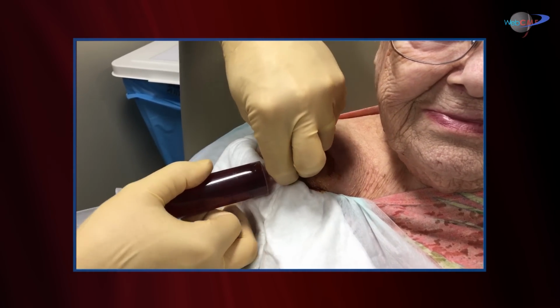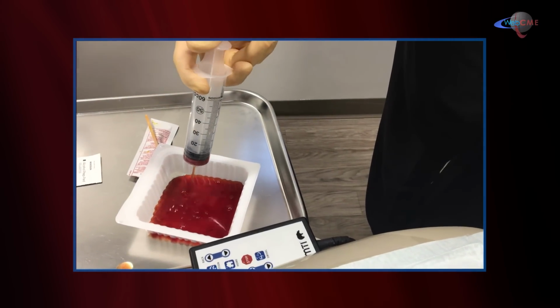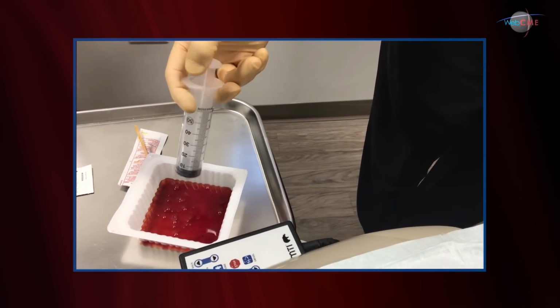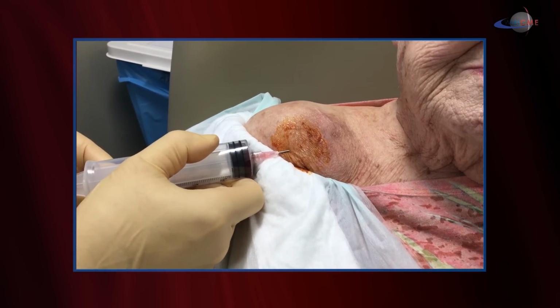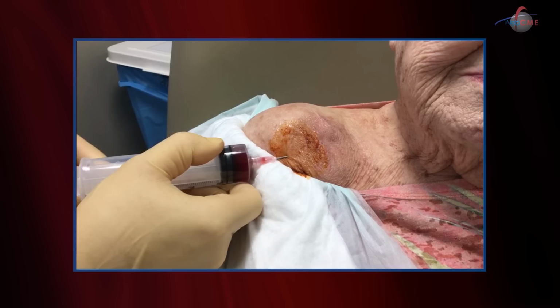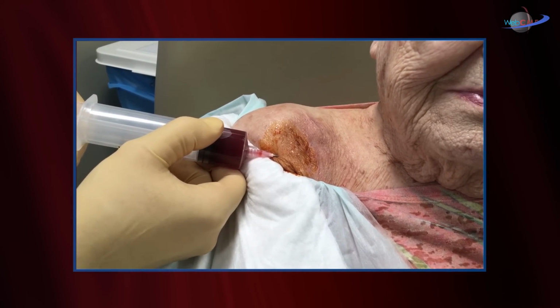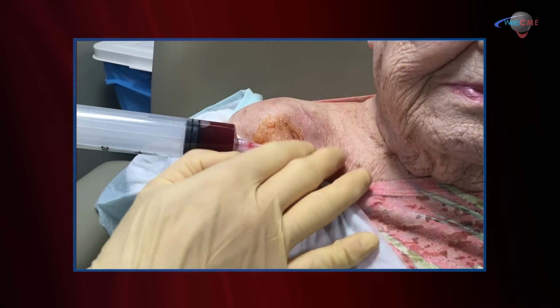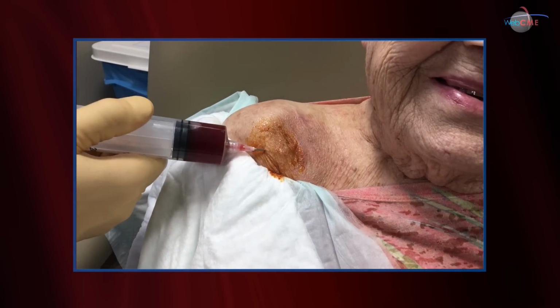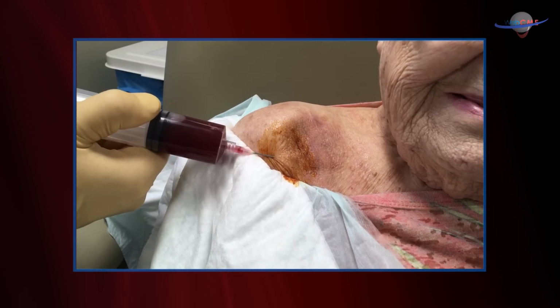Now, Betty, I am going to need to change this out because we came to the end of our syringe. Take this off. Just empty this syringe. You can see it's sort of gelatinous. It's sort of thick. The viscosity is fairly impressive, and we'll just reattach and try to draw some more off. There we go. Just about there, dear. And you can see I've collapsed that pretty well. And now we're at the end of our draw.